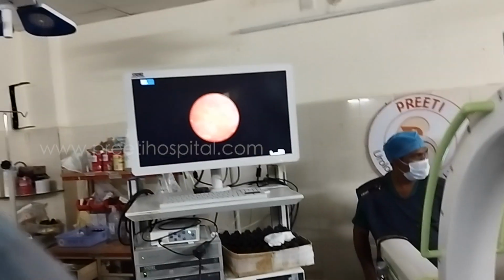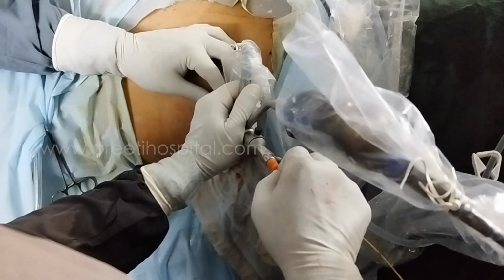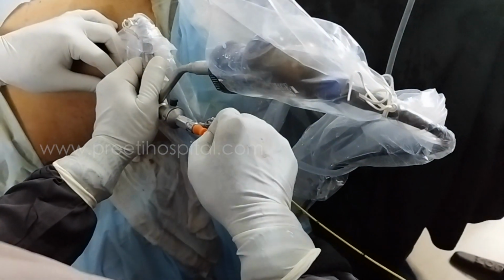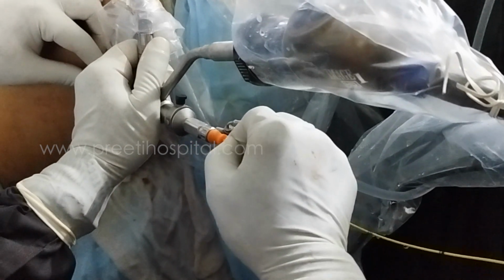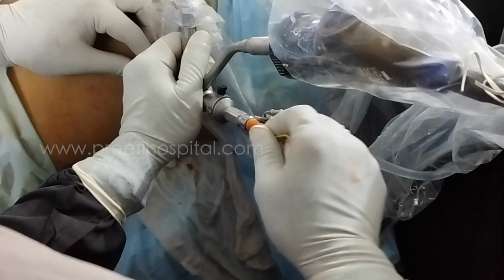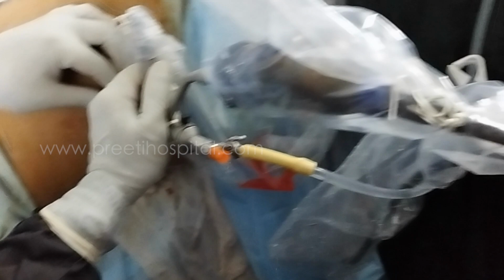Now you pass the guide wire. And I will take out the guide wire. Try with the one which is more ideal. Over the guide wire is more ideal. Push inside. That also you try. It is anyway not going. I don't know why it is not going. Sometimes the junction, the soft end, will not allow. So better to pass the guide. It was already there. So the guide wire will definitely pass fast.